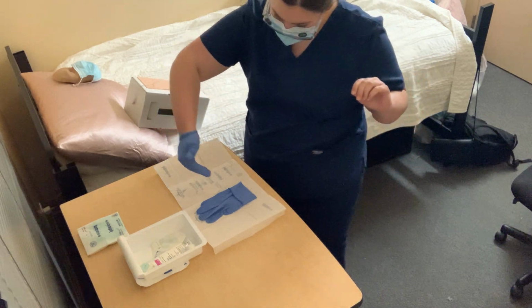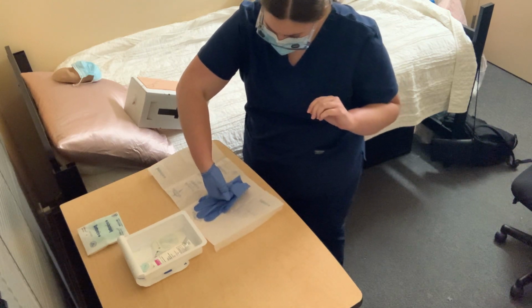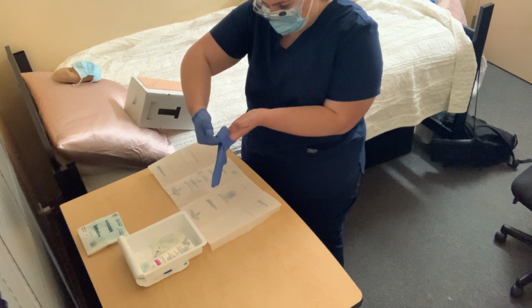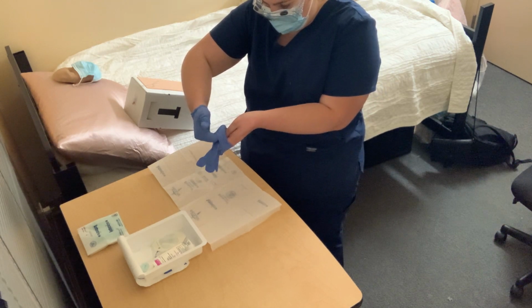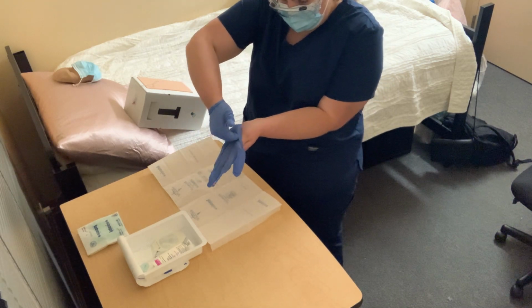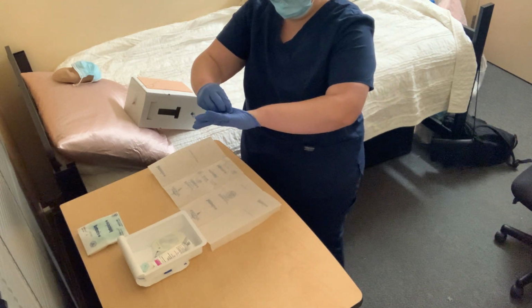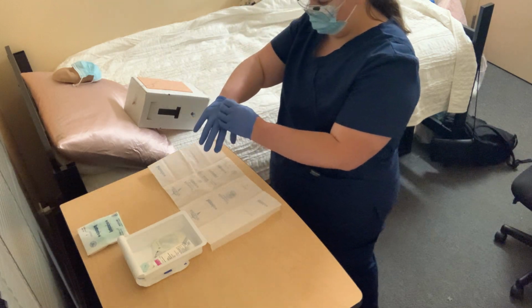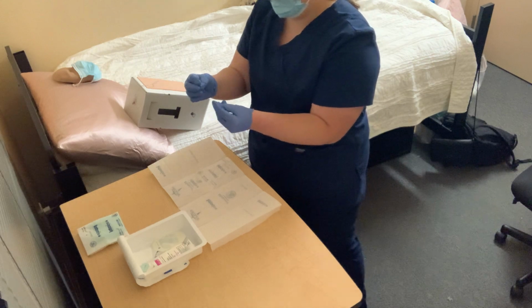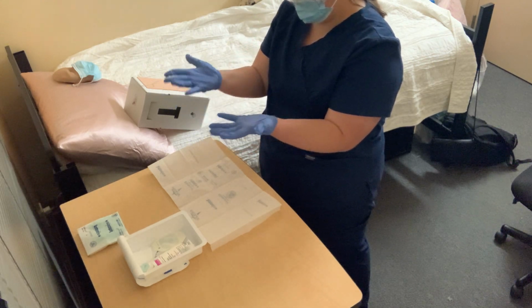And then I'm going to go under the cuff of the other glove to put onto my left hand. And now that both gloves are on, I can go ahead and just touch the outside to fix it up. All right. So my sterile gloves are on.